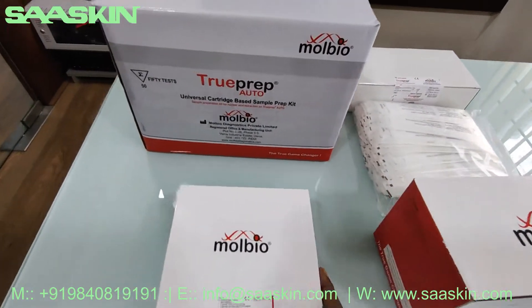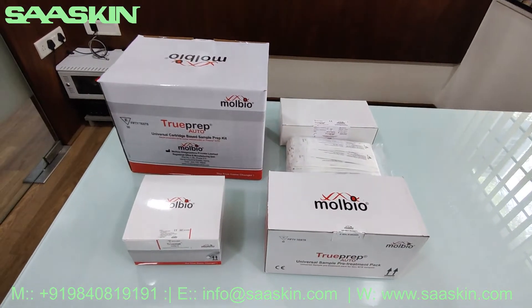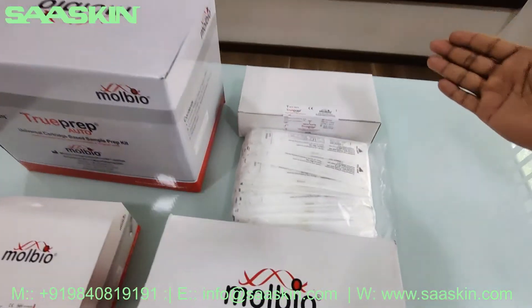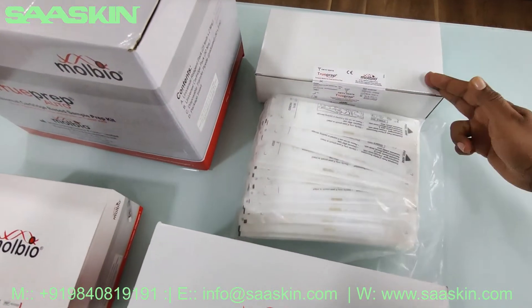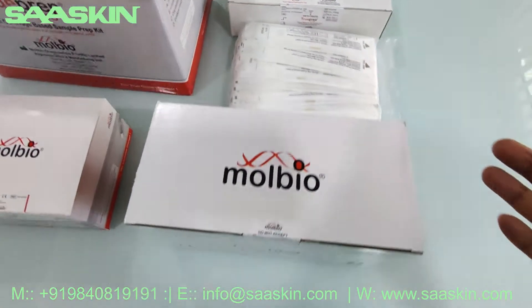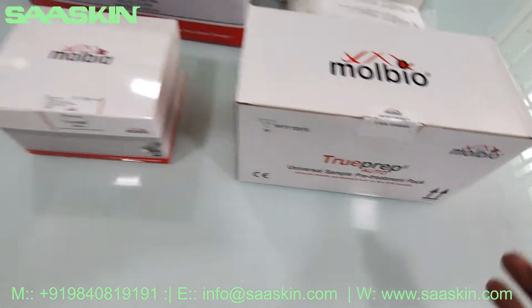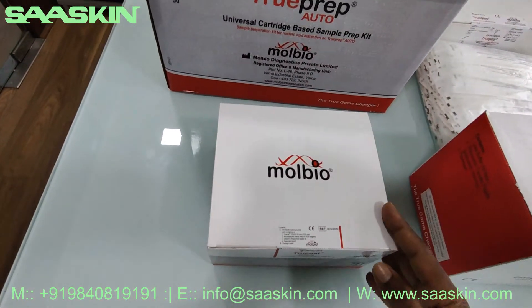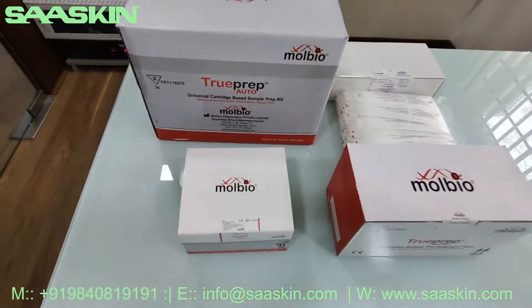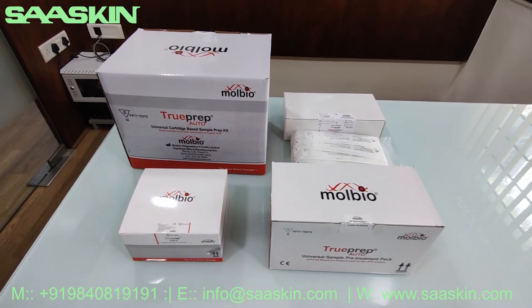Just a quick summary of the total setup required for doing the test in the TrueNat instrument: you have the VTM tube separately packed along with the separate pack of swab sticks, you have the universal sample pre-treatment pack, the COVID chip 50-number separately, and the universal cartridge-based sample preparation kit. This is the complete set used for the Molbio TrueNat instrument for PCR COVID testing.